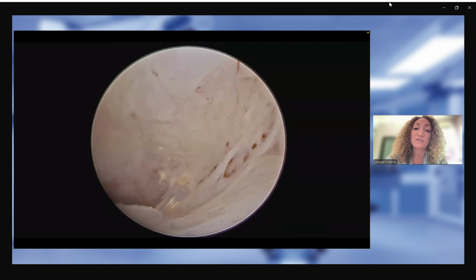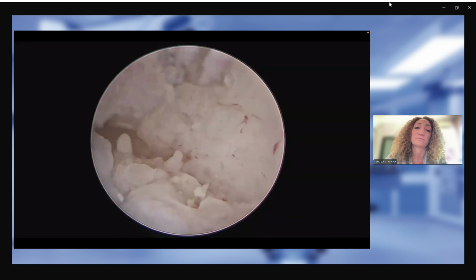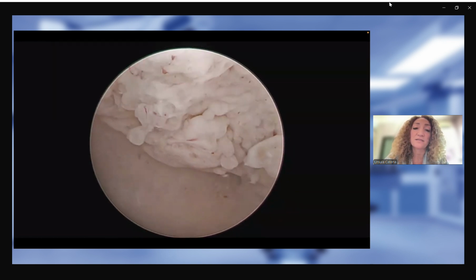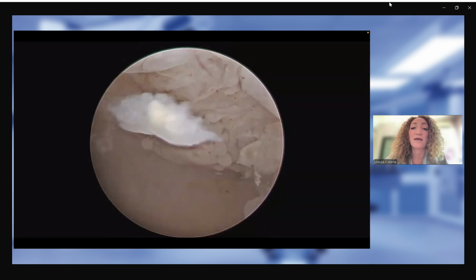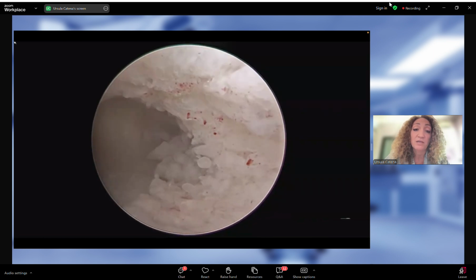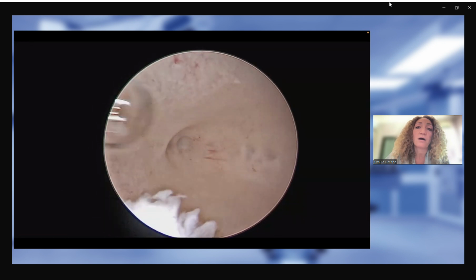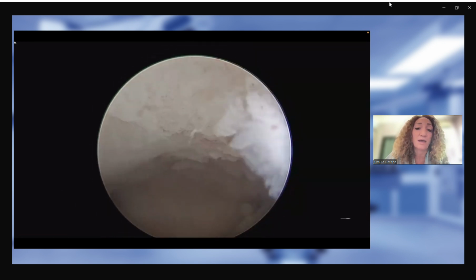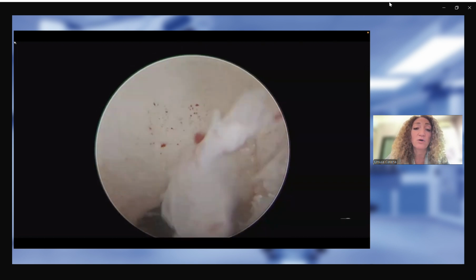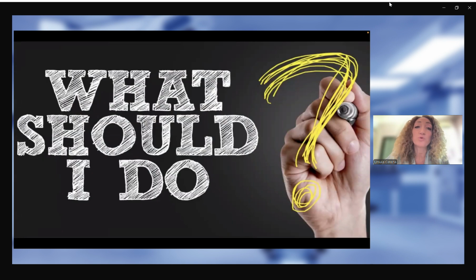Let's see what there is inside the uterus of this patient. I think everybody of us can recognize hysteroscopically in this patient a focal endometrial cancer. So it is a thing that happens, surely not frequently, but it happens to find small endometrial cancer inside the uterus of these patients, or focal endometrial hyperplasia. So what do we have to do in this patient?